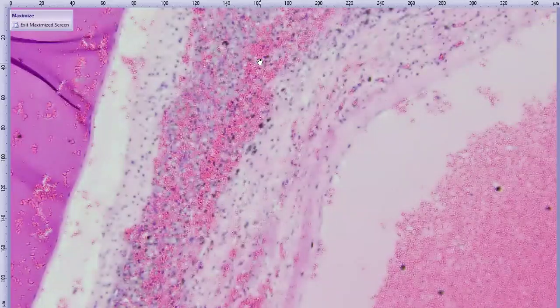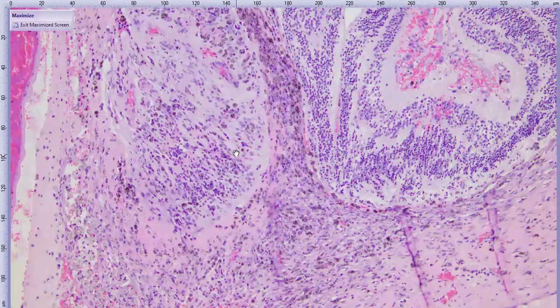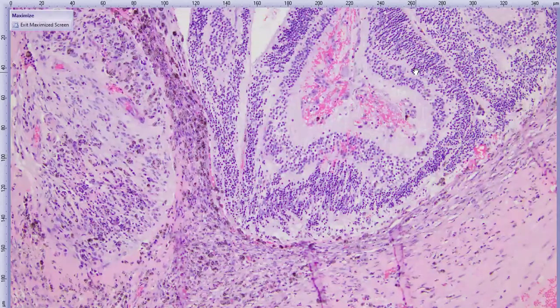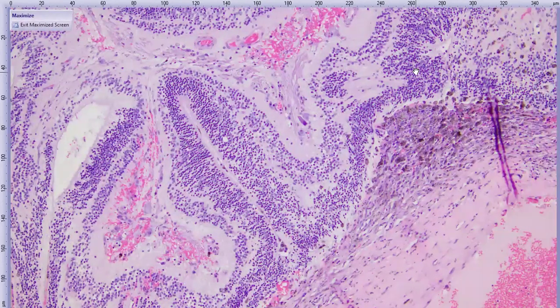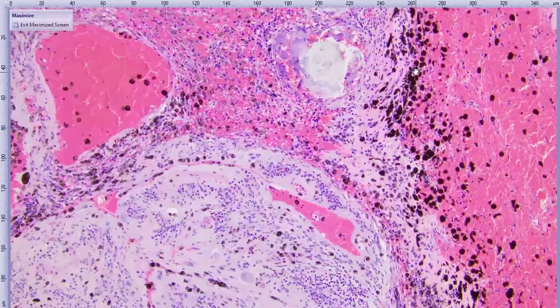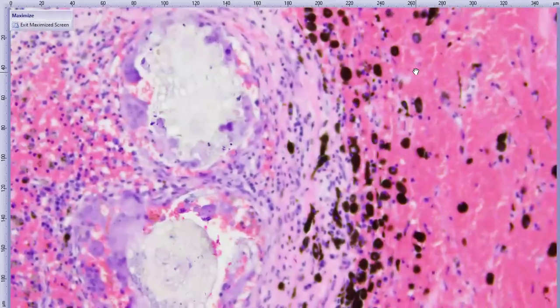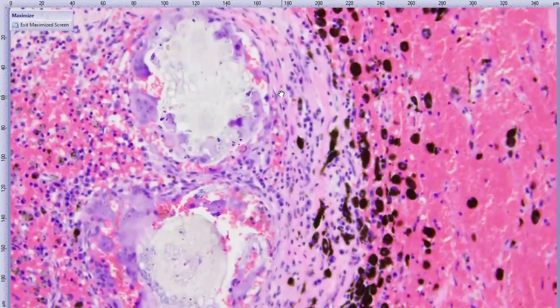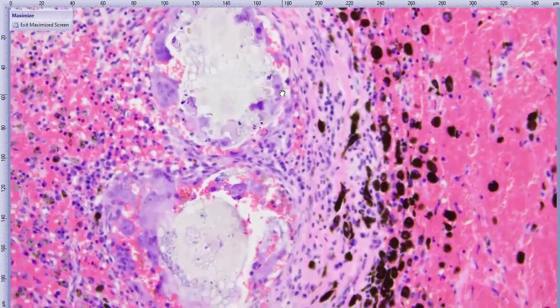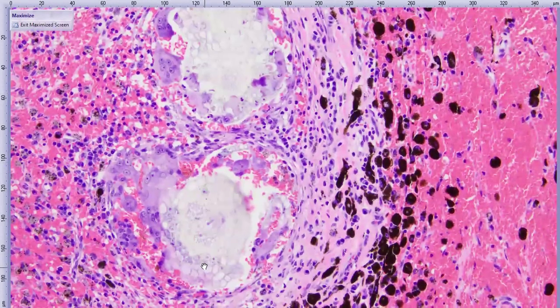And then our hemorrhage and fibrosis again continues around the lens. Here we've got evidence of chronic hemorrhage with the hemosiderin-laden macrophages. You can see our balled up retina. And then as we continue going along, we come across our culprit here. So kind of here in the choroid suprachoroidal space are these refractile foreign bodies consistent with plant material. And we've got a bunch of multinucleated giant cells trying to gobble them up.